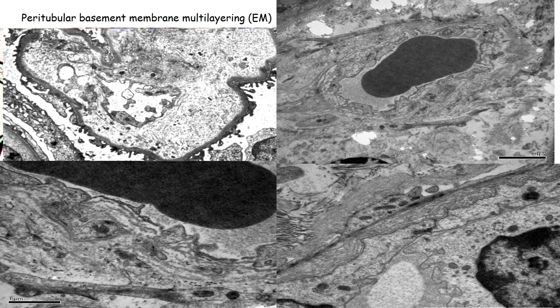These are the first changes that come in patients having chronic rejection phenomenon, and hence it has now become almost mandatory to do the electron microscopy so that we can find out if the patients have already started developing chronic changes and then modify the treatment accordingly. I have just quickly summarized all the morphological changes for you of both active and chronic T-cell mediated rejection along with active and chronic humoral rejection.